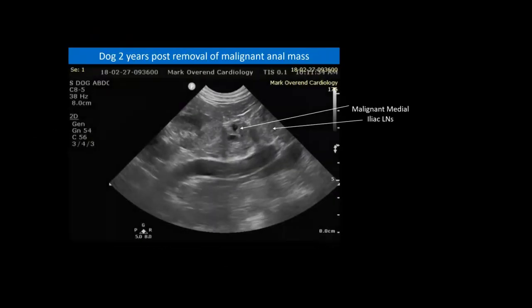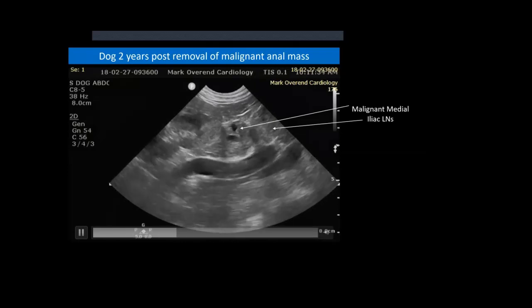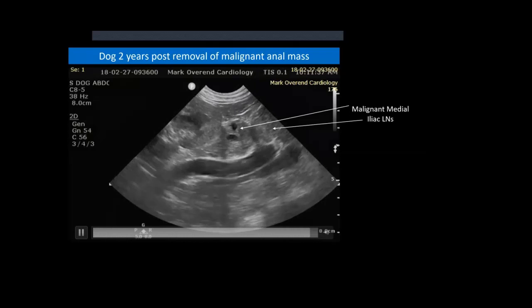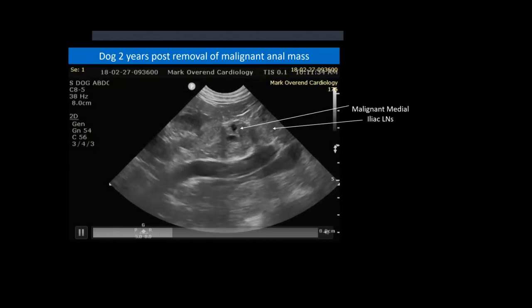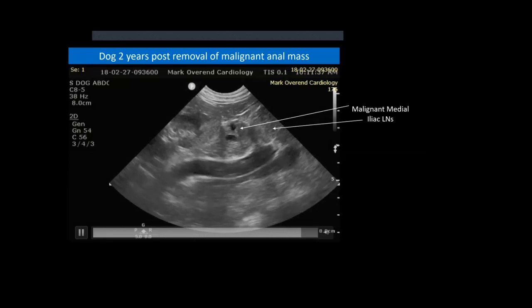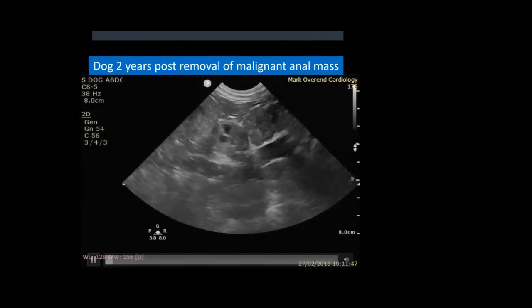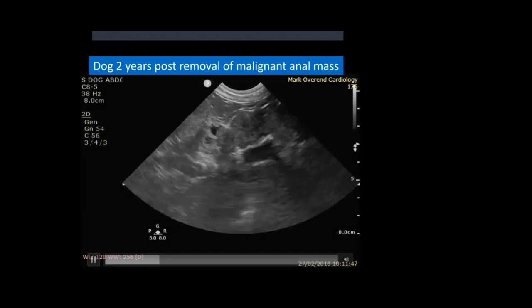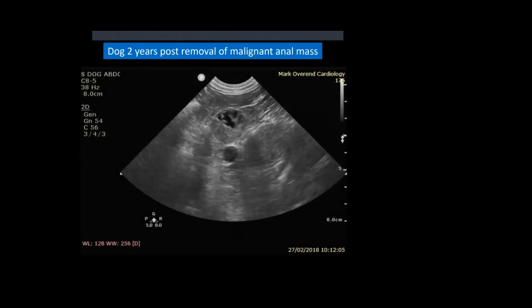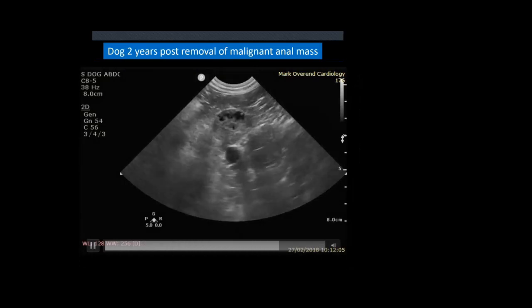Here's another case to give you a flavor of what these can look like. What you can see is a long axis view of the aorta, and below is the caudal vena cava. To the left or cranially is the kidney. Again you can see some malignant golf ball-like structures which are the medial iliac lymph nodes - they're heterogeneous and there's a cluster of three. You can just see the aortic trifurcation there, three fingers visible.